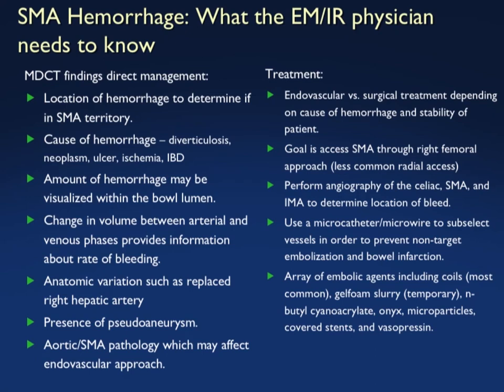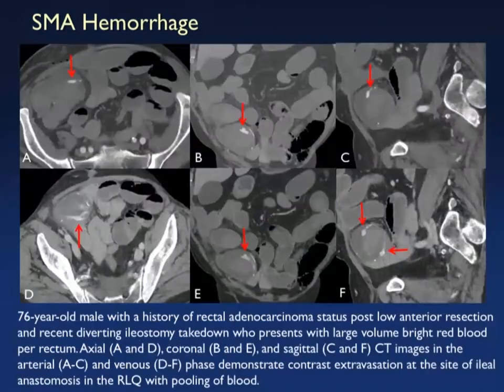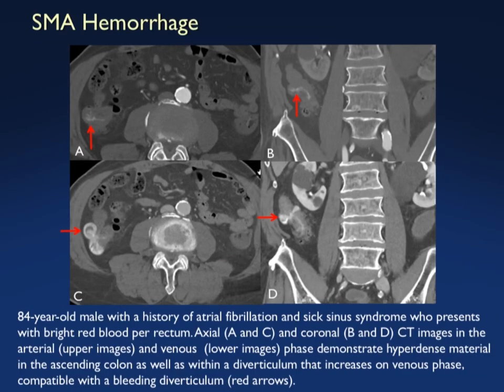Ideally these days with bleeds, it's usually going to interventional radiology, with embolization done in a number of different ways. Here's a case of a patient with history of rectal cancer with resection and diverting ileostomy presenting with bright red blood per rectum — you can see extravasation by the ileal anastomosis. Another example: a patient with sick sinus syndrome and atrial fibrillation shows a right-sided diverticulum with active bleeding. The blood is best seen on venous phase imaging, though also visible on arterial. With both phases, accuracy approaches 100%.